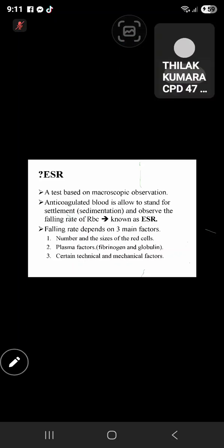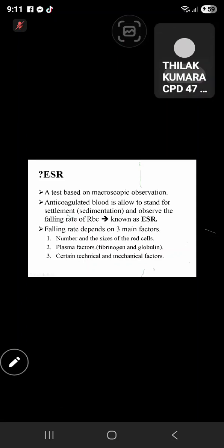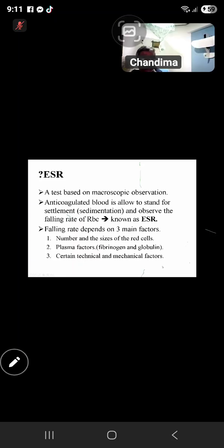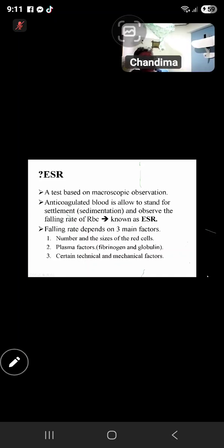Right. Someone asks, in a modern machine, does it automatically mix the sample? Yes. In some modern machines, with an autoloader, they mix the sample before aspirating the sample into the sampling probe. They mix the sample 3 to 6 times before the aspiration.